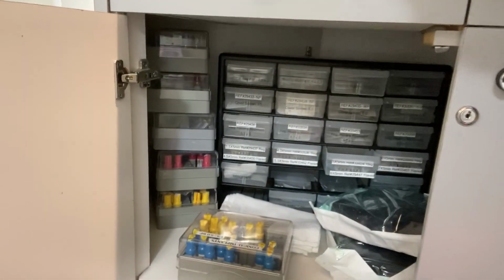The surgical guide comes first to the assistants. They prepare it for the procedure. And as the patient comes in, we make sure that the guide is there, that we have the right implant for the case, and also a backup implant. Here's the implant inventory, so if you need a rescue implant, you have implants that are greater or smaller in diameter, greater or smaller in length, so you're prepared. So this is the operatory.